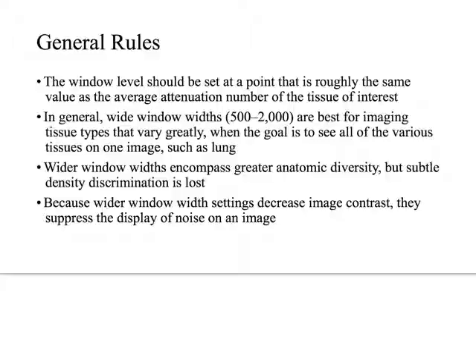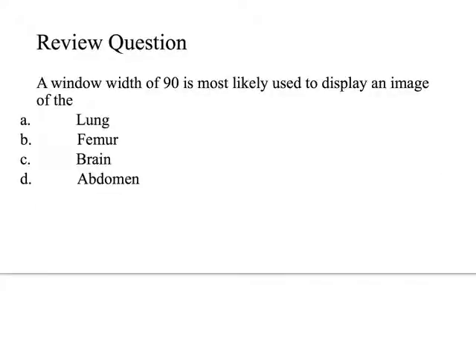And because that wider window width decreases image contrast, it will also suppress noise. So the higher contrast images are going to look noisier, and the lower contrast images will look less noisy. Higher contrast, more noise. So here's another review question for us.